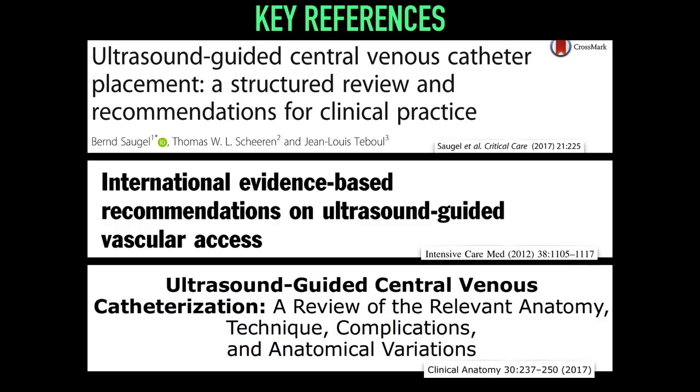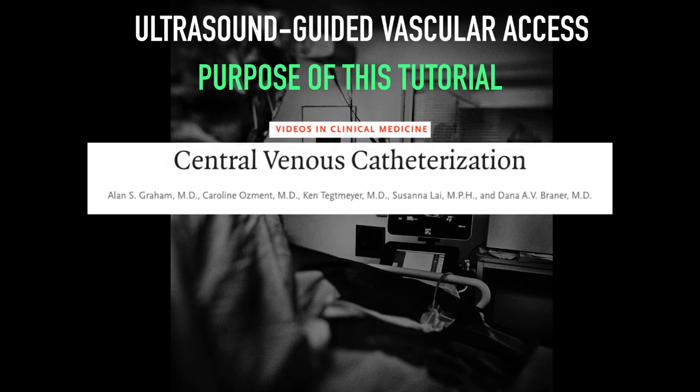This tutorial was designed by a culmination of clinical experience and through these three key references. If you'd like to know more, I would suggest you take a look at these as they are very helpful. The purpose of this tutorial is to really hone your skills in the use of ultrasound in guiding central venous catheterization. This video should be viewed as an adjunct to the video in clinical medicine from the New England Journal of Medicine. This really is an excellent video as it demonstrates the entire procedure from start to finish.